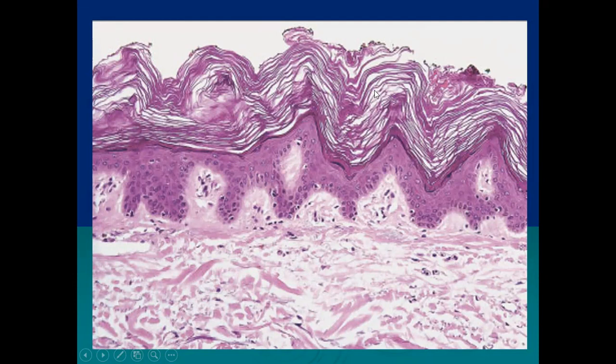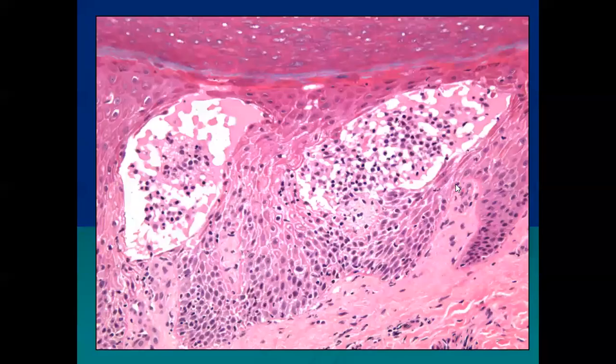And in this image, you see another important feature, which should be appreciated because this is a very typical and diagnostic feature of eczema.